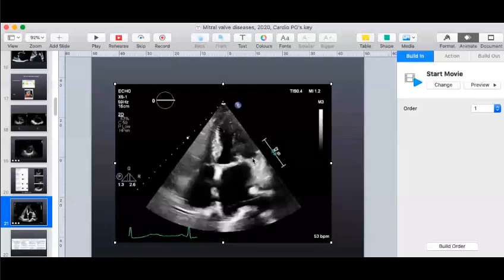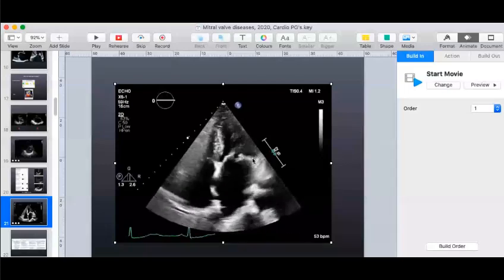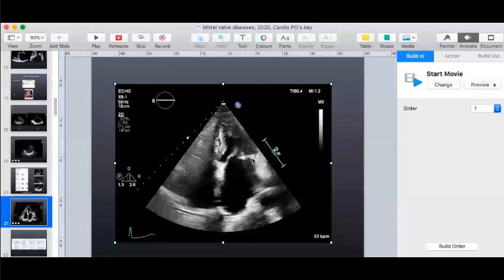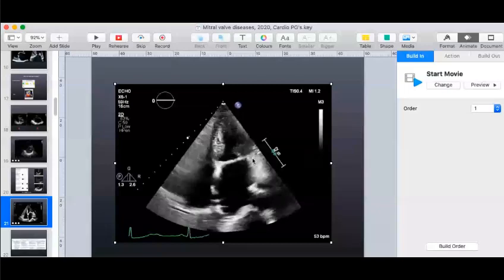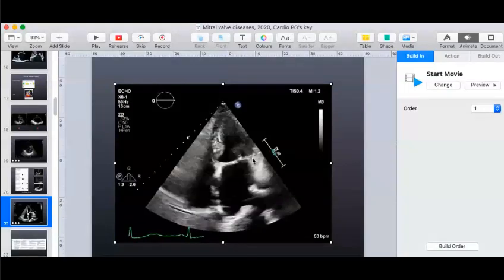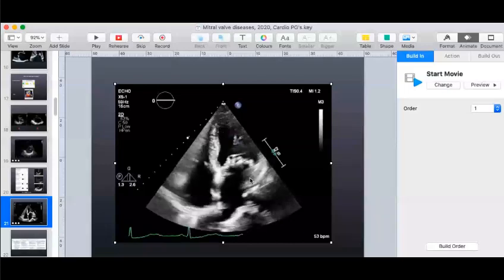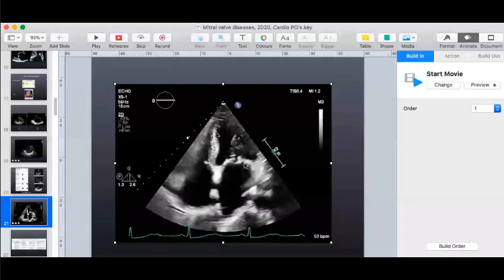So the last one, what is the other important finding which you need to describe? You mentioned the valvular apparatus is thickened. All the entire body appears to be thickened. Right, so there is some significant subvalvular shortening, right? Yes, sir. Okay, so that would be the description roughly of what we can assess from this particular view of the mitral valve. Now, what do you think of the left atrium?